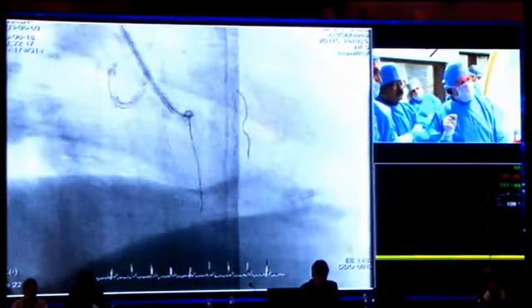Yeah, we are with you. As often happens with the antegrade, of course, the struts overlay. So I couldn't get a Corsair through the struts, so we did dilatation with a Minitrek 1.2. And then we got the Corsair through.